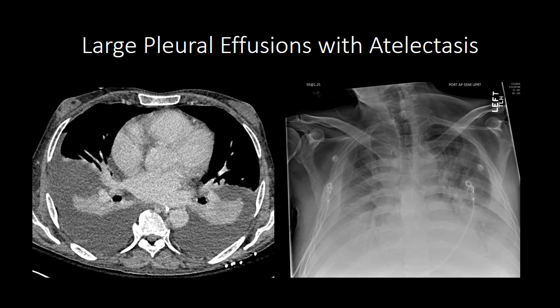Here is the chest CT from the same patient. You can see these large pleural effusions, and then the completely collapsed lower lobes almost floating out in the effusions. You can imagine why the combination of both the fluid and the collapsed lung without gas causes very dense opacification of the lung bases.